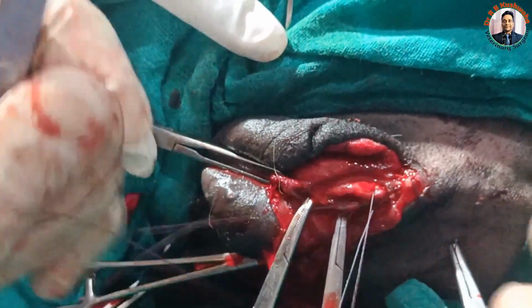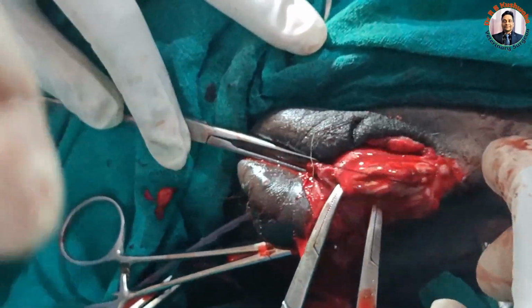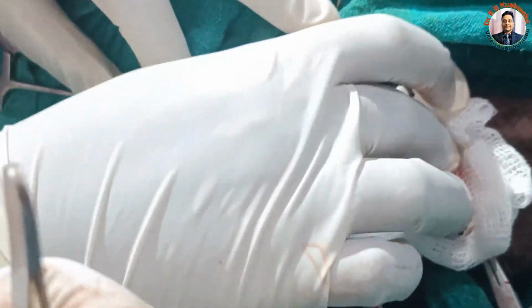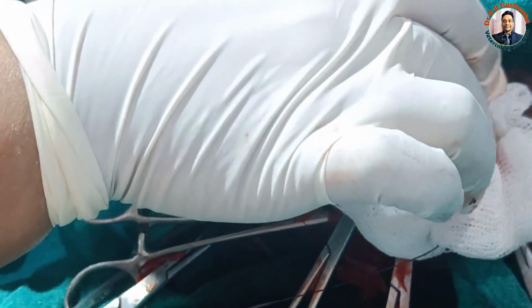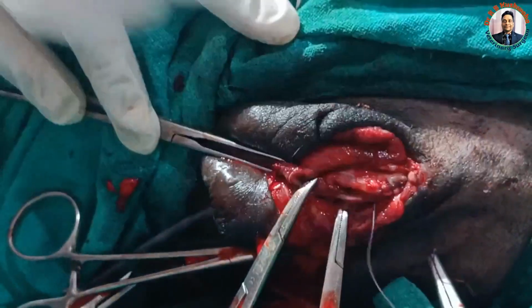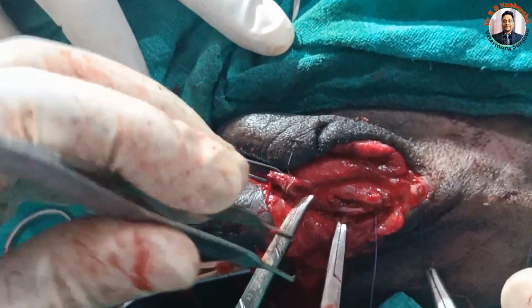If it is too loose, it becomes a diverticulum-like structure, or there is a swelling at the ventral aspect. And if it is too tight, there is a chance of dehiscence.